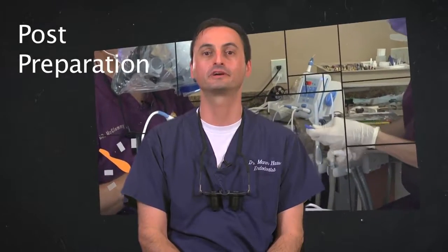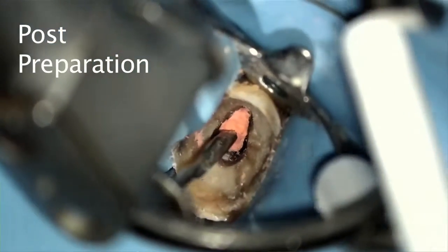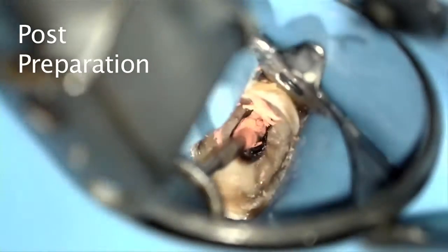Third, I'll speak about post-preparation. Preparing a post space in canals obturated with GuttaCore is quite easy. Simply wait maybe about 30 seconds or so to allow the GuttaCore to set, and then you may use nearly any drill you wish to make your post space. This could be done the same way as you would with plain gutta-percha obturations.